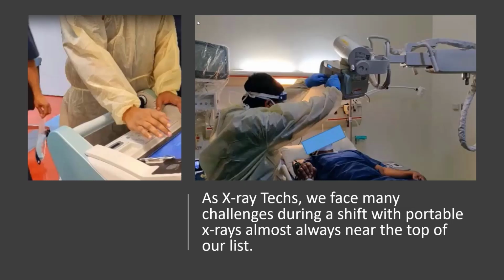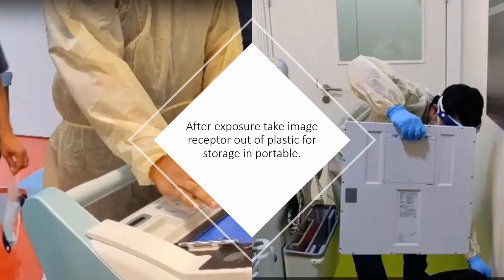Proper infection control adds a lot of steps and work to each and every examination. To do the exam correctly and to maintain a sterile or aseptic type of technique takes time. Also, disposing of the contaminated materials that are disposable makes a difference. Where do you take the image cover that you've just had over the image receptor and dispose of it?